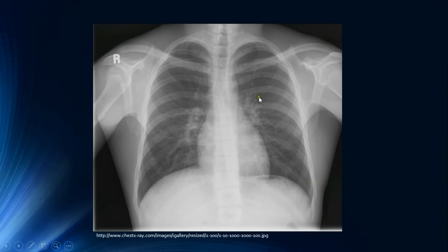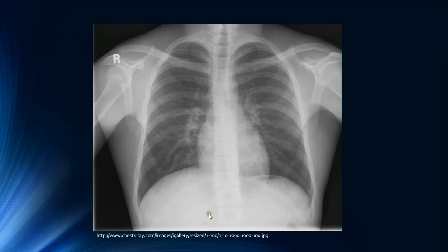Moving to D — diaphragm and delicates: the right diaphragm is slightly higher than the left, and we cannot see any free air under the diaphragm — the air visible here is actually the gastric bubble, the air inside the stomach. E — effusions: there are no effusions blunting the costophrenic angles.